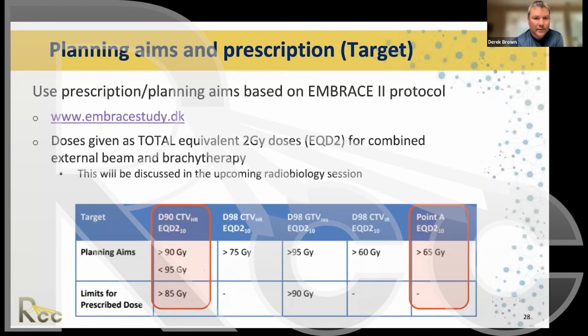We also have these EQD2 defined doses, also coming out of this EMBRACE trial out of Denmark.